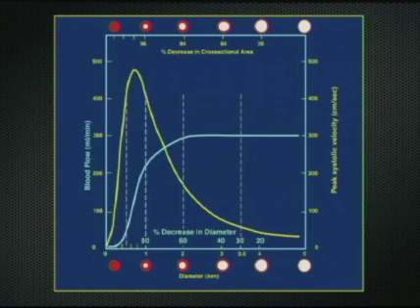With ultrasound, we depend on neither of these methods to evaluate stenosis. We depend rather on an assessment of the change in velocity of the blood as it passes through the stenotic segment. This looks like a rather complicated diagram, but is one that is very important in understanding how Doppler ultrasound contributes to the assessment of stenosis.